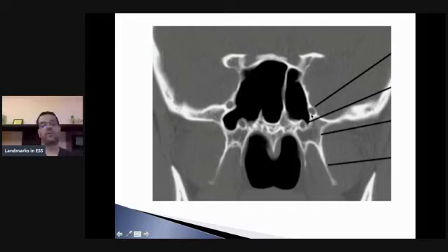Looking into the sphenoid sinus landmarks, remember, you have certain foramina that are important. I'm going to show you one important variation that you can see in your cases. So obviously, this is the foramen rotundum, and this is the really big Vidian canal, and you have the lateral sphenoid recess right here. Lateral sphenoid recess is even bigger and clearer on this side. I see the V2 canal, foramen rotundum anteriorly, and then the Vidian.